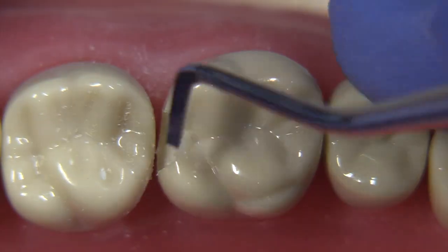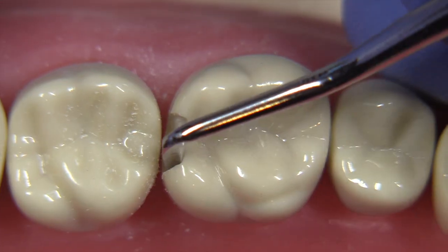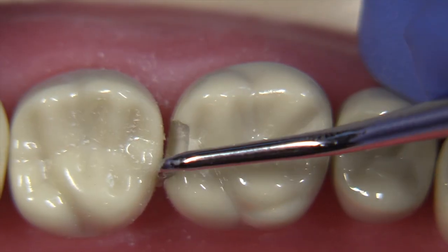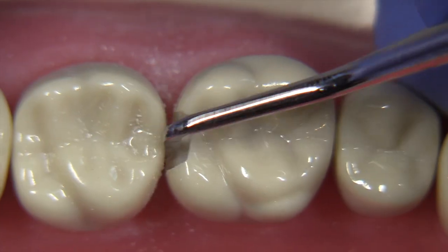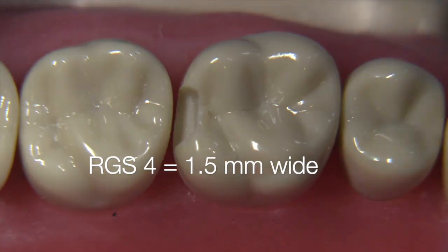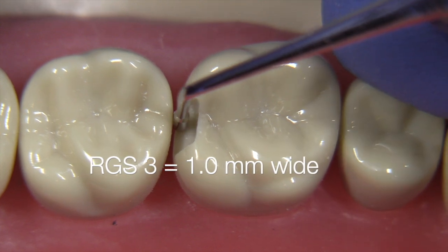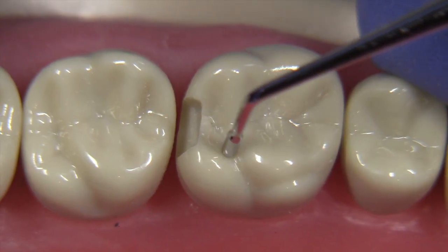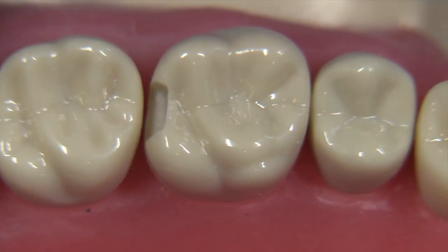The box is nearly completed. We are doing this so that we know exactly what kind of outline form is required for retention, or at least how to make the outline form on the occlusal flow with the box form. I'm double-checking the axial depth here - it's less than 1.5 millimeters and more than one millimeter. That's the RGS3 which is one millimeter, and that's about how wide we want to make this extension up on the occlusal area.